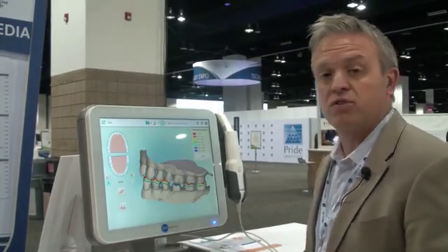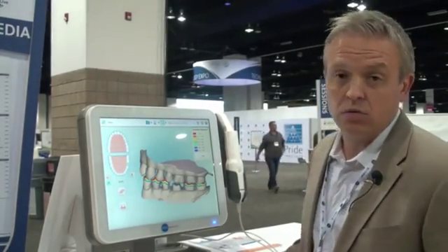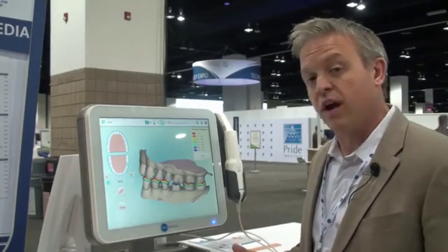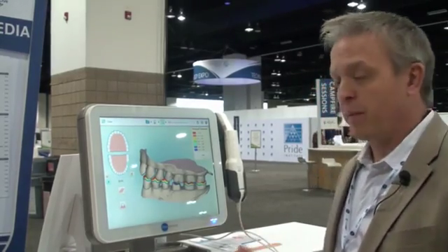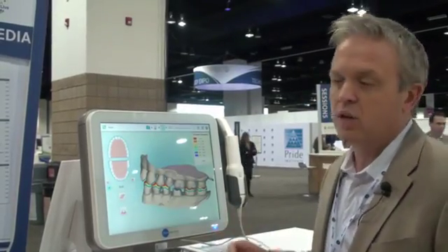We have a lot of doctors asking, is this just an orthodontic scanner? And the answer to that is no. iTero has been around for about 10 years and it started out as a restorative scanner only. So four years ago we started doing Invisalign scanning. What I wanted to show you was a restorative scan.